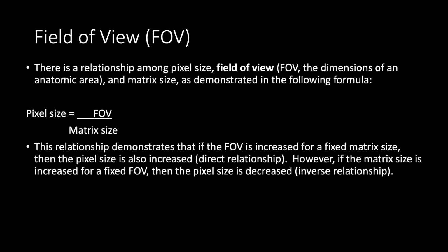However, if the matrix size is increased for a fixed FOV, then the pixel size is decreased, and that's an inverse relationship, or inversely proportional.